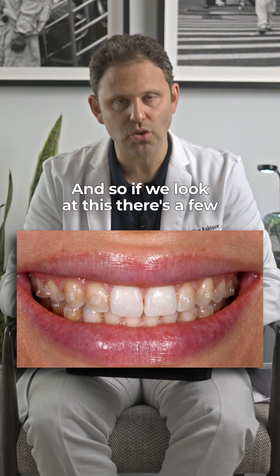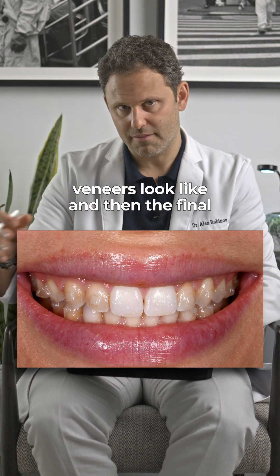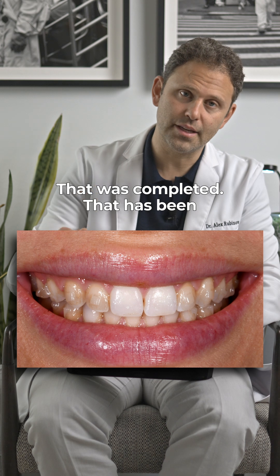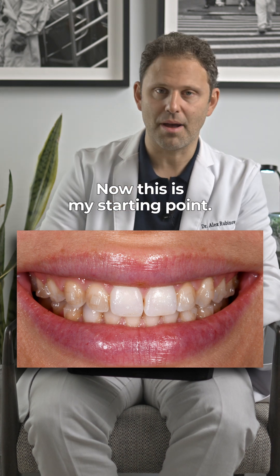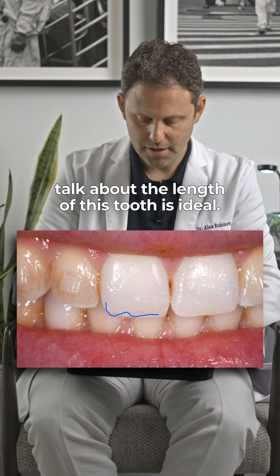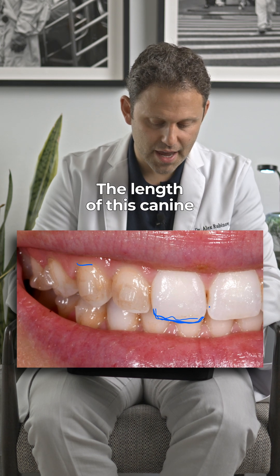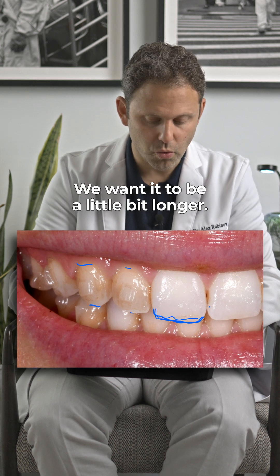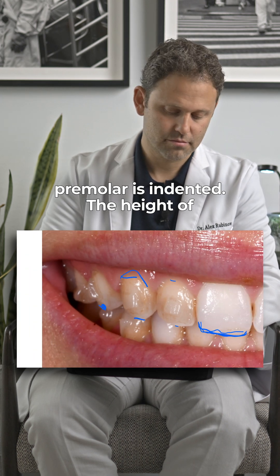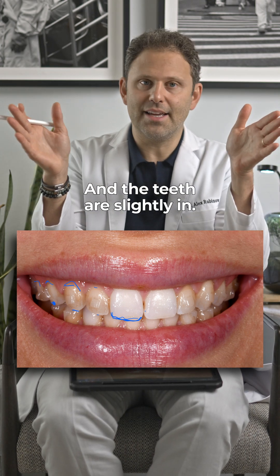So if we look at this, there are a few things going on. I'm going to walk you through the entire case — what the preparations look like, what the veneers look like, and then the final outcome. She had crooked, rotated teeth. That has been evened out. This is my starting point. The length of this tooth is ideal, but this one's short. Invisalign is not going to correct for all that. The length of this canine is the same length as this lateral — we want it to be a little bit longer. The edge of this premolar is indented. The height of these gums are lower and the teeth are slightly in.